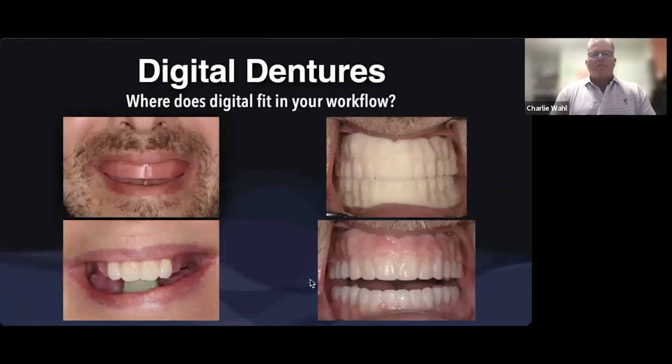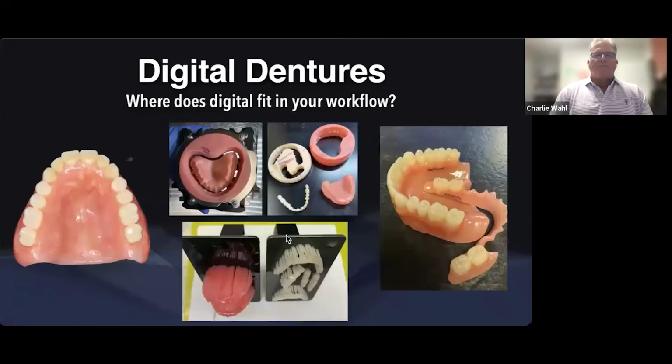But if something was really off, if I had to do a lot of adjusting, I'm going to do a second try-in. But because we really utilize reference position, the amount of try-ins we now do in the digital world is so much less. I would say almost always we're doing one, very rarely a second try-in, because we really have fine-tuned the ability to use these points to guide us, that back in the edentulous world, we had this big vast space.